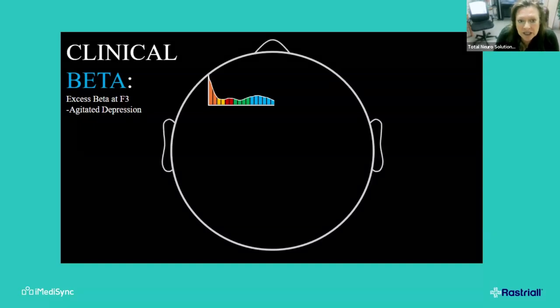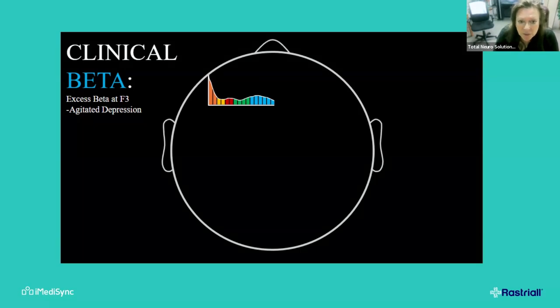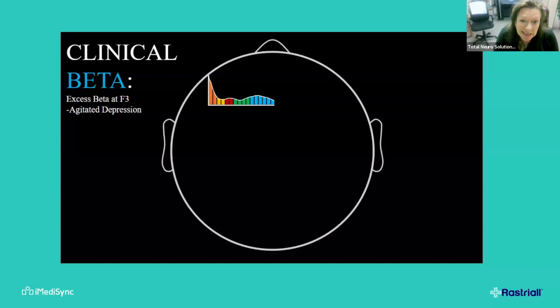So looking at the EEG is very important, not just for the diagnosis, but for how we are going to intervene. Which medications are going to work? If you gave an antidepressant to the clinical case represented by this slide, it would be ineffective, because SSRI antidepressants lower frontal alpha, but they actually exacerbate beta.